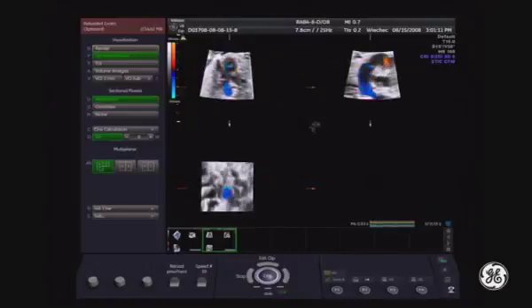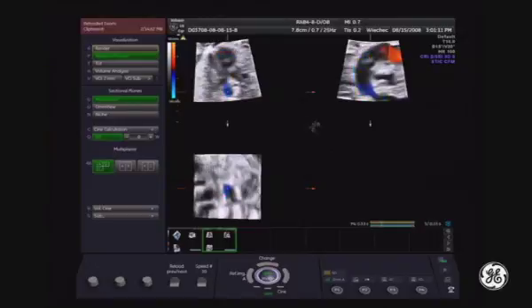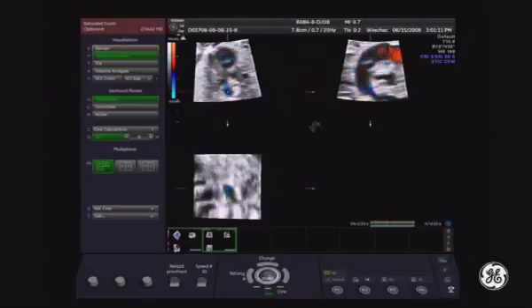So let's try to bring the pivot point in A to the level of the descending aorta. This is here. I will bring it vertically, and you start seeing that the ductal arch is formed in the B-plane. I will try to move the pivot point in the B-plane to the lower level.